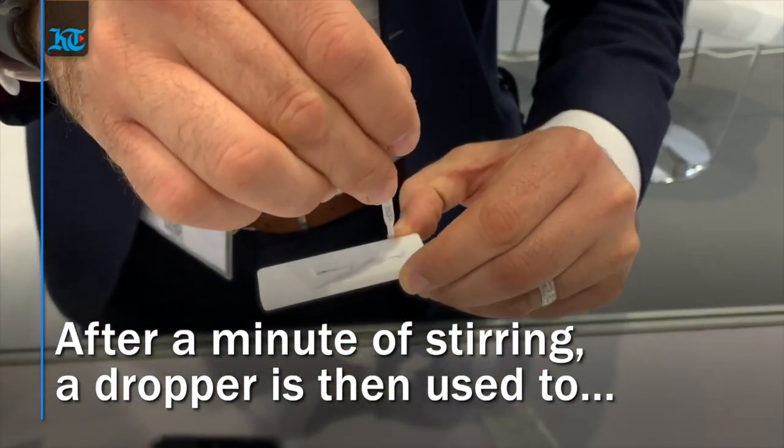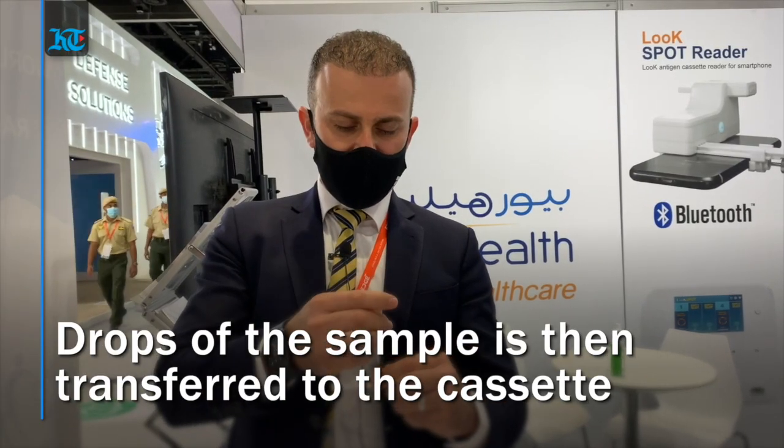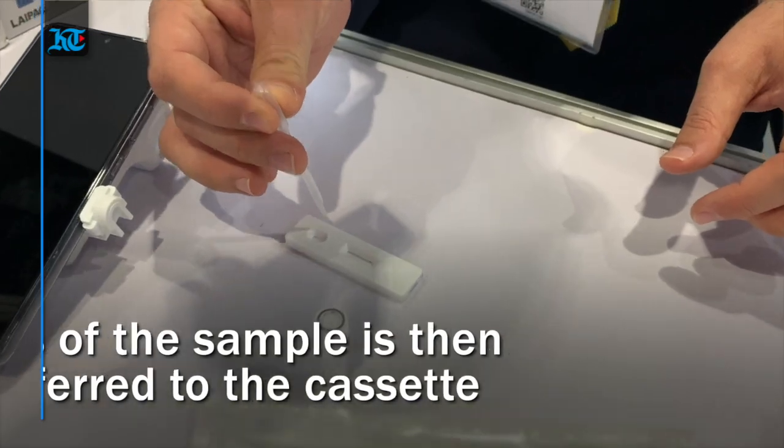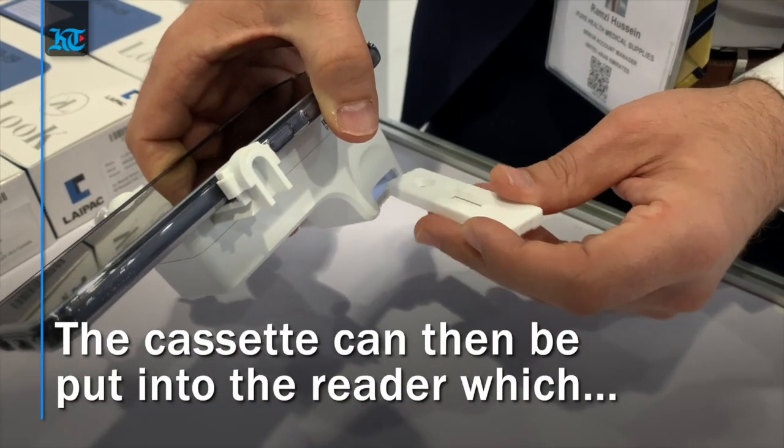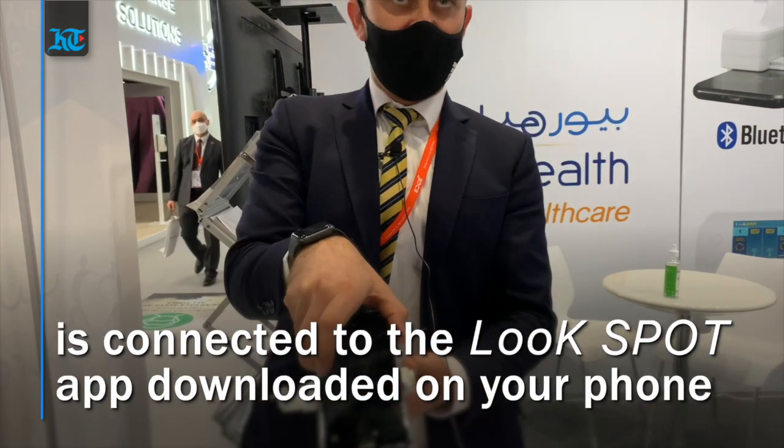Using the rubber dropper, take a small amount of the sample and place it onto the cassette — the COVID-19 antigen test — adding two or three drops. Immediately place it into the reader and you can have the result in five to eight minutes.